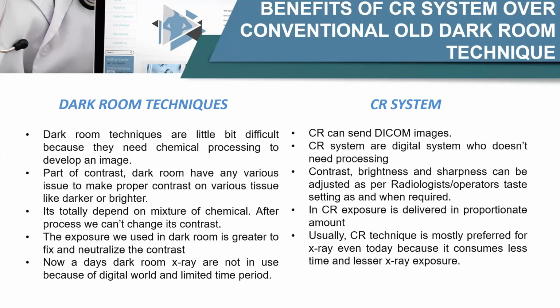Nowadays, we don't use darkroom techniques to develop an image. Usually CRs are very good, and actually I'm doing it for the last 3 years, and I'm getting a good workflow after using this. Next slide, please.